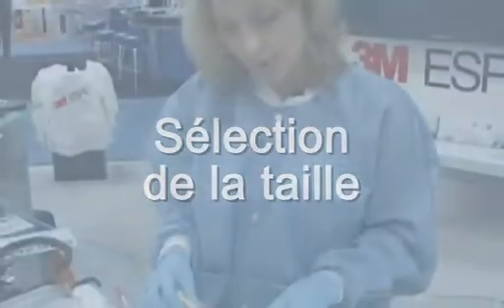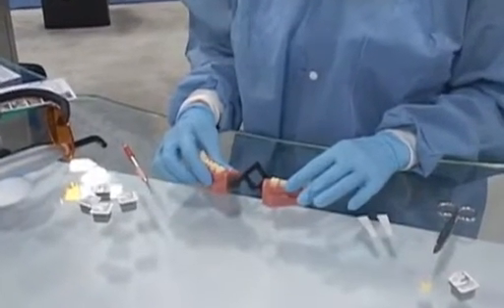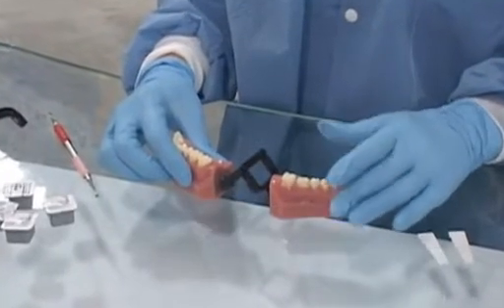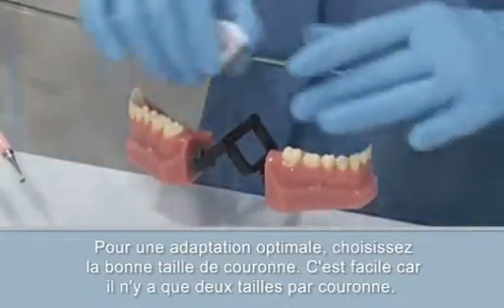If you're looking down here at the model that we're going to be working on today, the first thing I tell assistants is I want them to really look at the prep. I think a lot of times when any type of provisional restoration is fabricated, they're not really looking at the teeth themselves, and this is really what's going to decide the sizes that we're going to use. With the Protemp Crown, there's a small and a large.